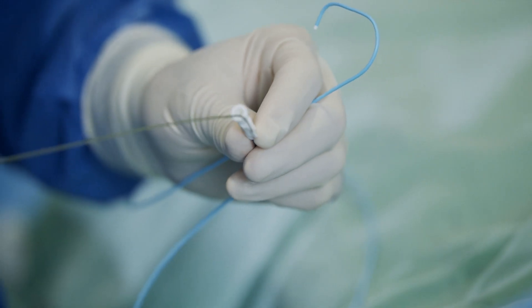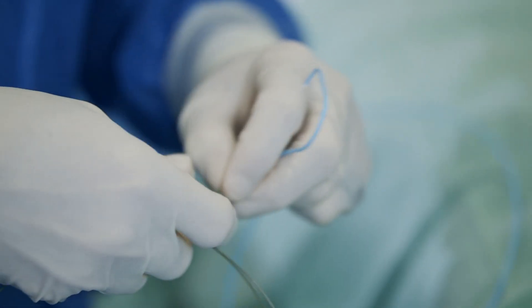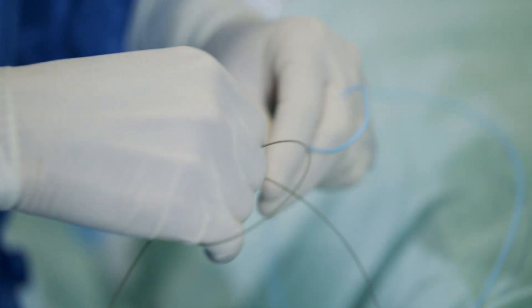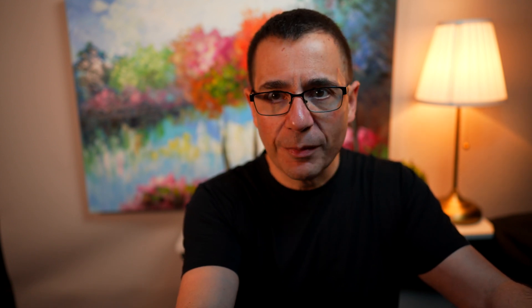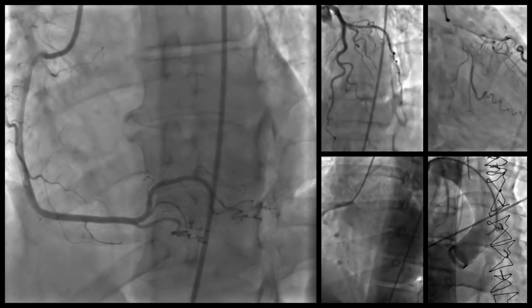Through this end — the wires, the little balloons, the stents — all go through here. They travel from the wrist all the way up the forearm, around the collarbone and shoulder, and down into the vessel called the aorta. From there we position them by manipulating from the outside to introduce these catheters through the artery.